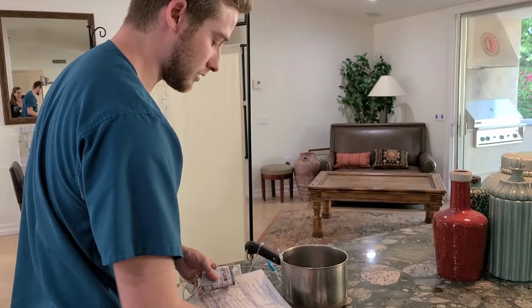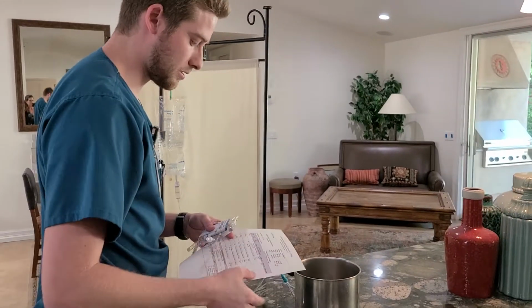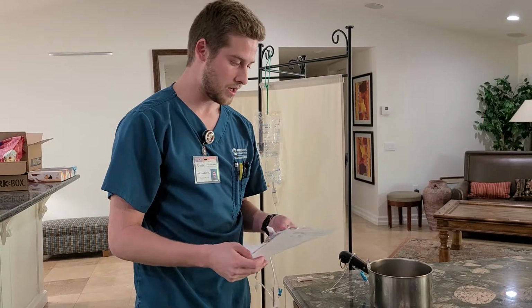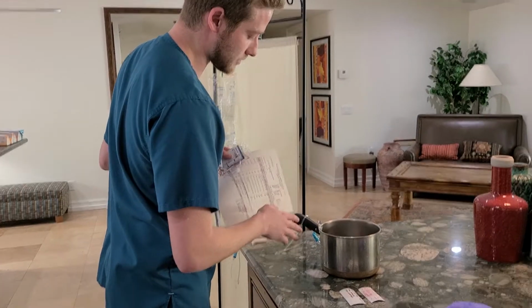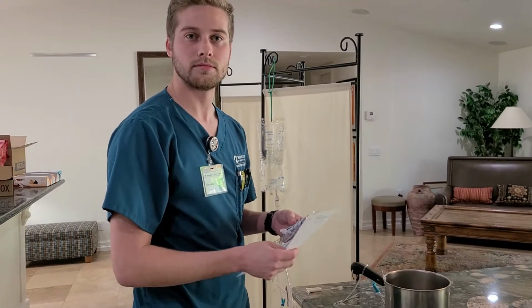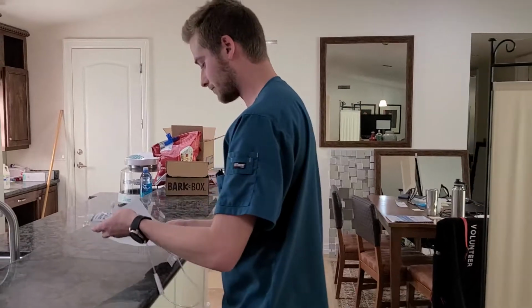I see you have an allergy alert band. What are your allergies? Tagamet and codeine. I see that here. What are your reactions to those? I get a rash. You get a rash? Okay, we'll make sure to not give you that. Now I'm going to assess your IV site for any signs of infection, redness, or swelling. There is no redness or swelling or signs of infection. Are you experiencing any pain? No. Perfect. Is it okay if I do my third check right now? Yes. Perfect. I'm going to go back over here and do my third check.